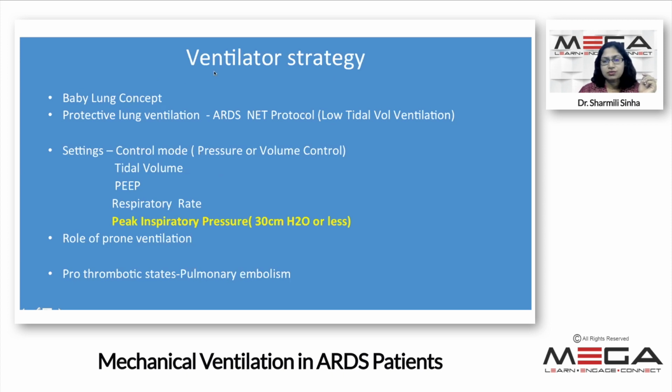As Dr. Ranajit was showing in his pressure volume graph, at one point of time, if there is over distension of the alveoli, it causes a fall in compliance. So in this context, there has been a landmark trial. I think most of us are aware of this protective lung ventilation trial conducted by the ARDS-NET protocol team. That is regarding low tidal volume ventilation. I'll just try to make it simple. Here the settings are mostly kept when you start putting a patient of ARDS on invasive ventilation.